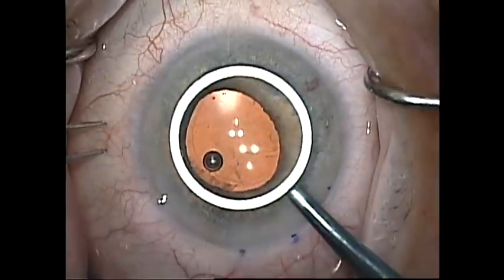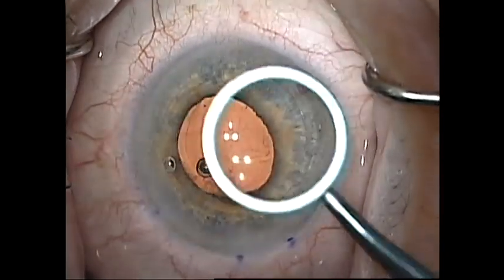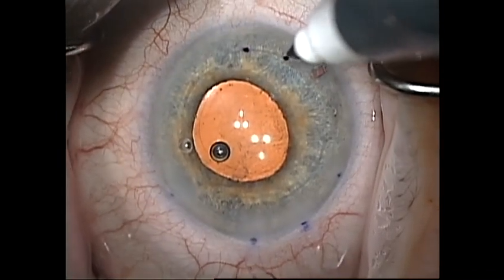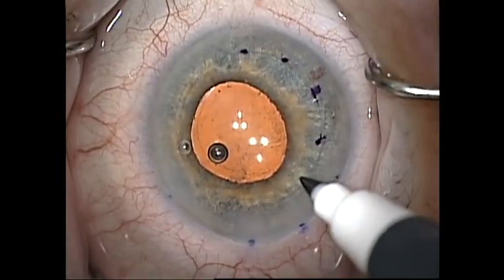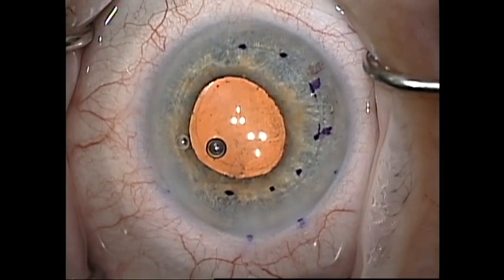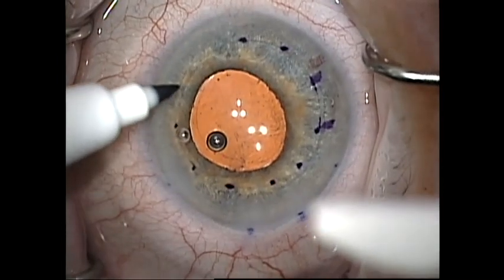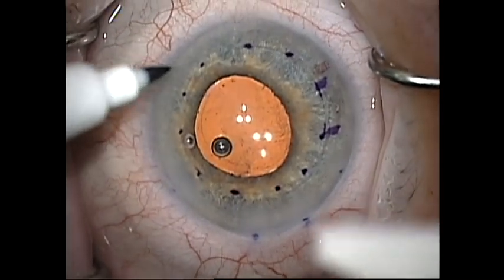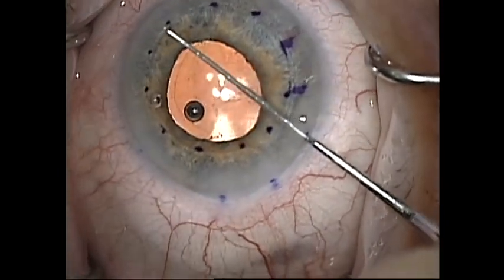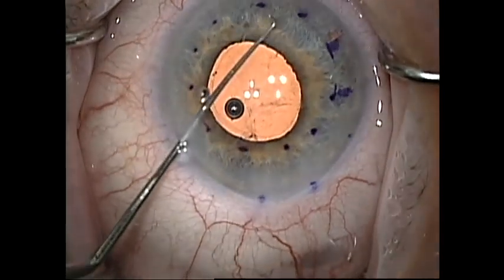Next I want to mark the area of the desmetorhexis. In cases of Fuchs' corneal dystrophy I generally mark an 8 mm zone of resection. In Fuchs' dystrophy the central area is the area with the most dysfunctional endothelium and the peripheral endothelium is generally fairly healthy. This is not so in pseudophakic bullous keratopathy where they may benefit from a larger graft size.